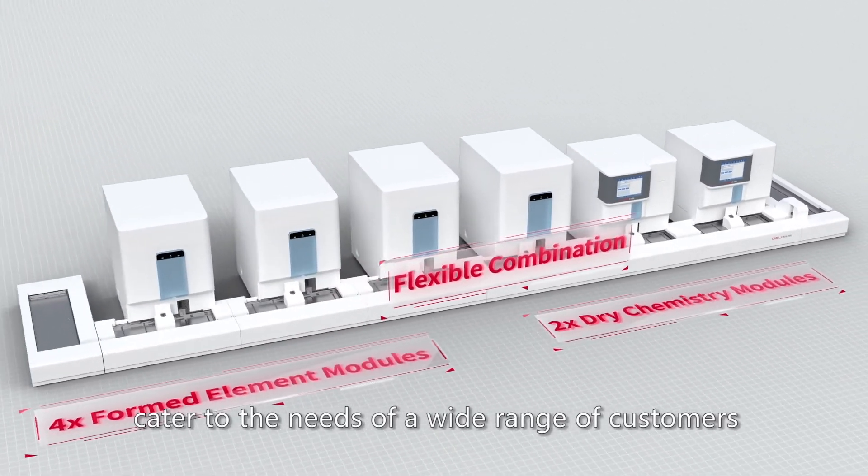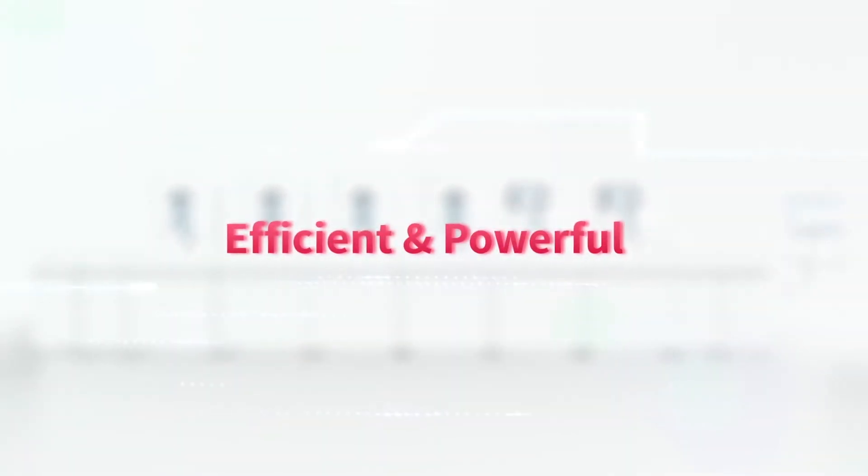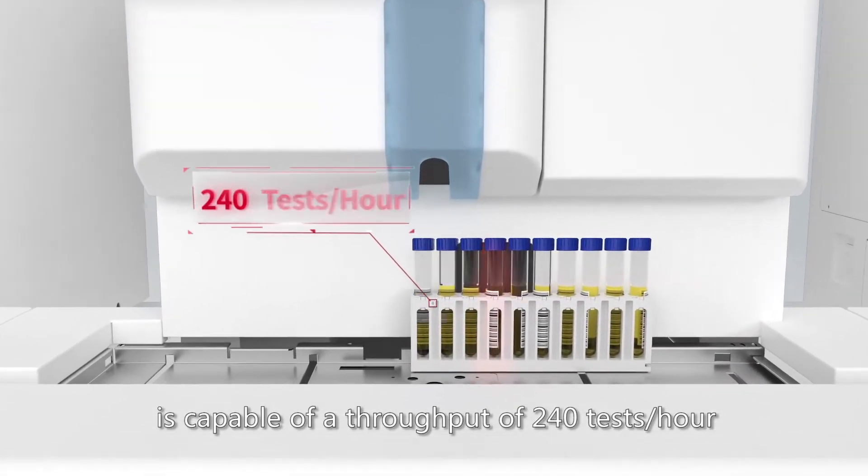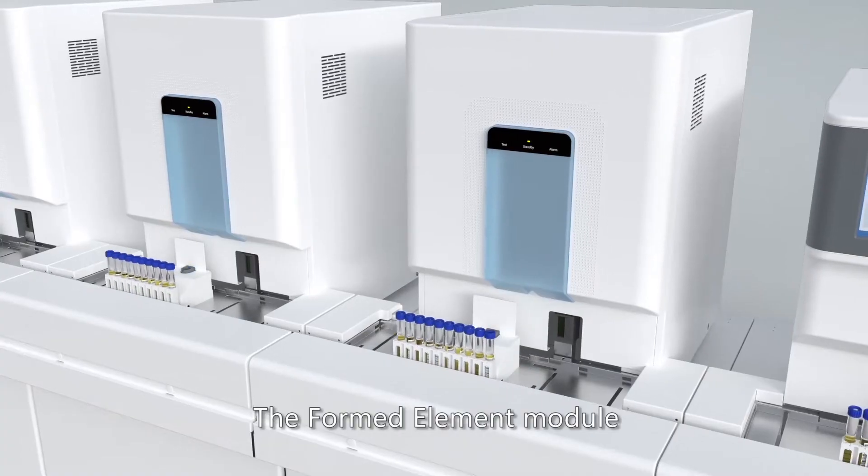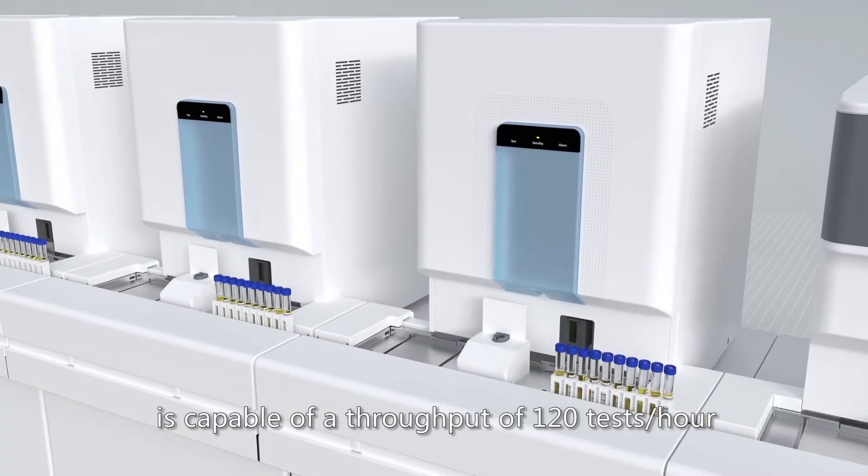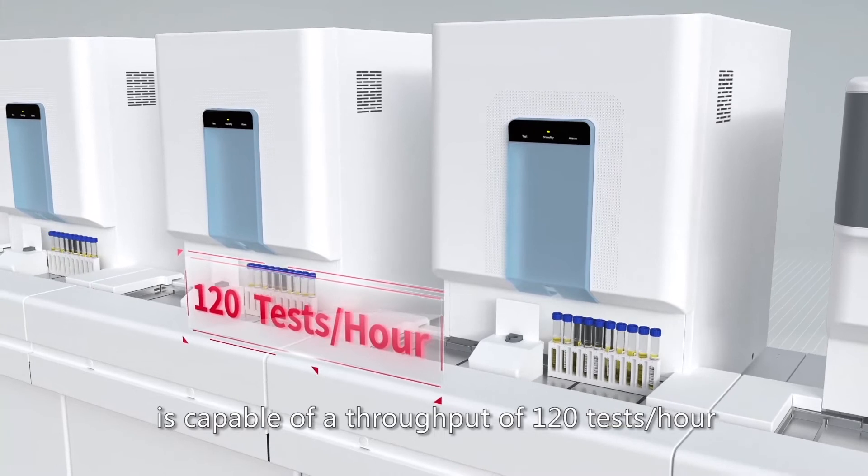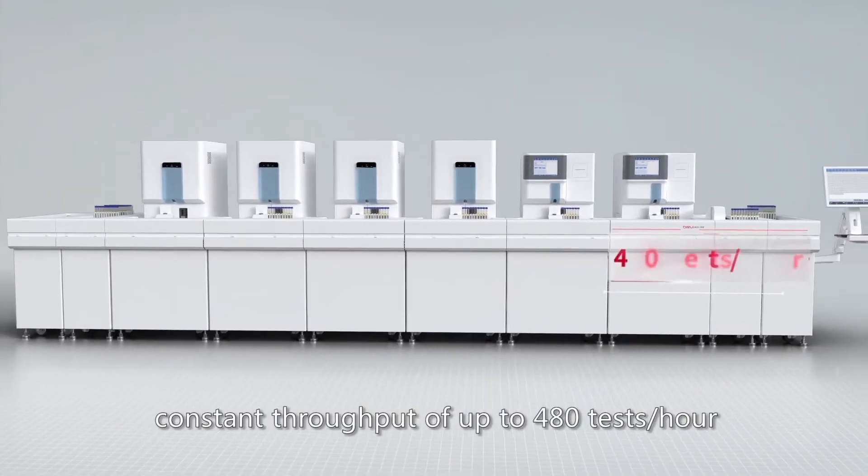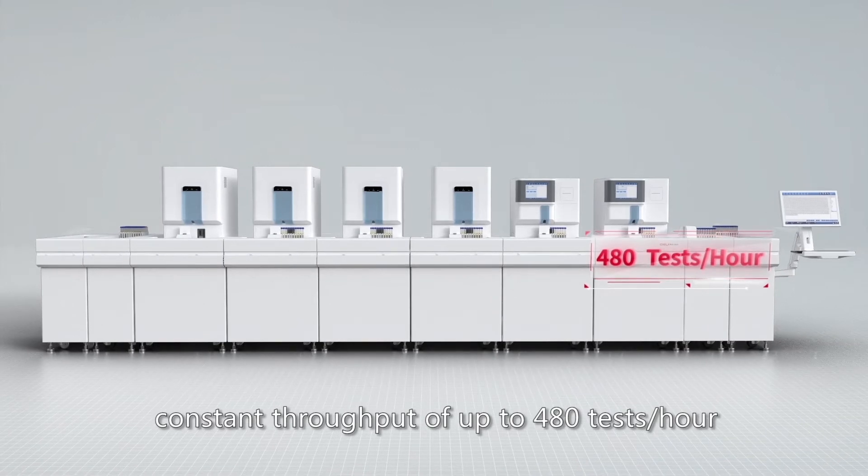The dry chemistry module is capable of a throughput of 240 tests per hour. The formed element module is capable of a throughput of 120 tests per hour. Combinations allow a maximum achievable constant throughput of up to 480 tests per hour.